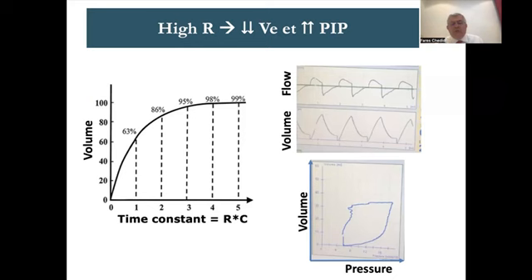So how would you know if, with this short I time, I need to increase I time or I need to suction the patient? You go to the volume pressure loop. As I see, there is another talk on the graphs, so they will show you the volume pressure loop. And the volume pressure loop, when you have high resistance, would be square, because here you have to push so much pressure and you gain barely any volume. And then during expiration, the pressure goes down so much and we don't gain any volume. So your graph becomes rectangular. And you see those zigzags in here, which are secretions.